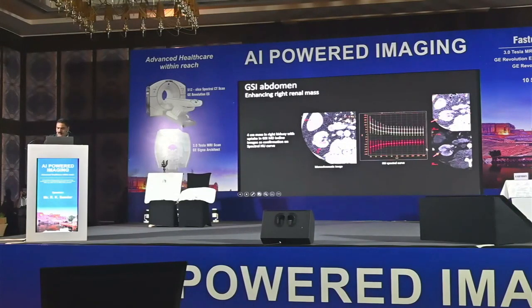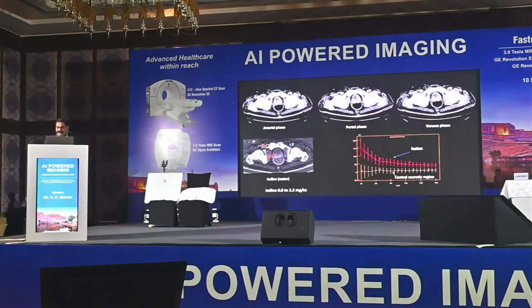This case was more challenging. Suspected enhancement. Really, if you look at this image, you are not able to see any enhancement here. Rather, it looked almost like a cystic thing with a pseudo enhancement. The moment you put a spectral curve ROI, you show the positive curve, an upward curve, which says that it's an enhancing lesion. So the entire diagnosis changed from a hyperdense benign liver lesion, renal lesion, to a renal mass. So that's the specificity of spectral imaging.